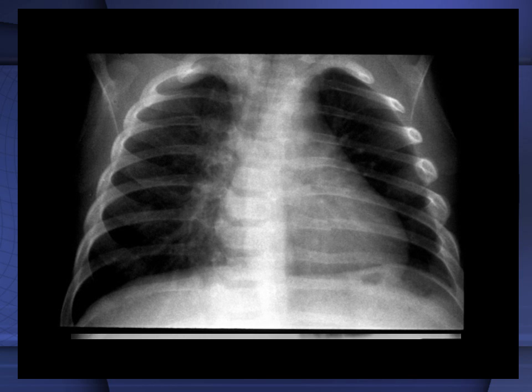Is the cardiothoracic ratio normal in this patient? If you answered yes, you would be correct. This is also a child, as we can identify from the funnel-shaped thoracic cavity, yet it's a little less funnel-shaped than in the prior film, and the thymus gland has become more residual. So outlined here then is the cardiac silhouette.